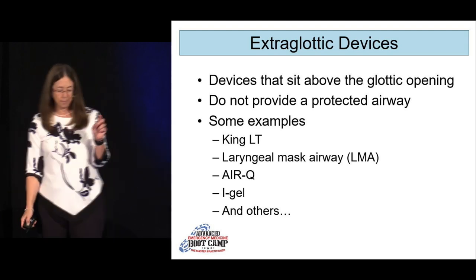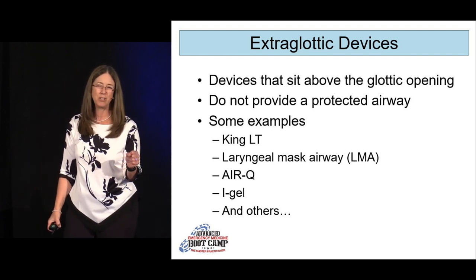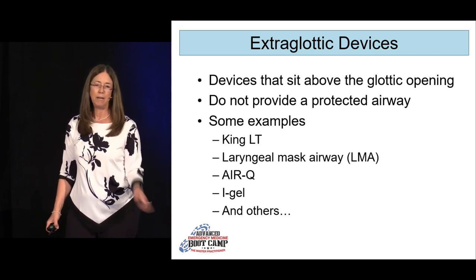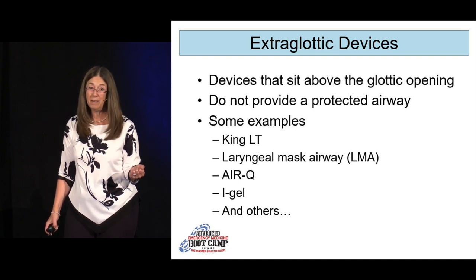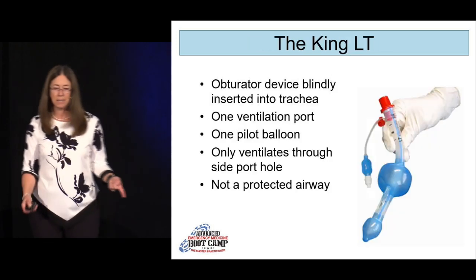And the key to this, so if you anticipate, you've got somebody coming in, and it's like, oh, that looks like a tough airway. Well, I'm not sure I'm going to get this one. Have one of these out and on the side of the bed, right there. Just have it right there to remind you that if you're struggling and somebody's saying sats dropping, take your laryngoscope out and put one of these things in, or bag them, but better yet, put one of these things in.